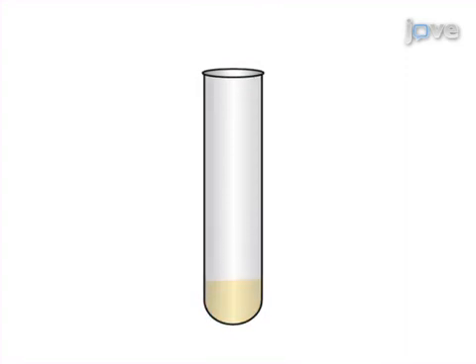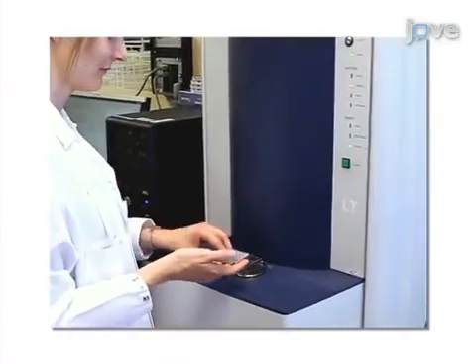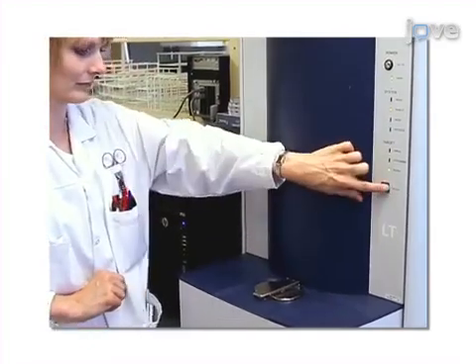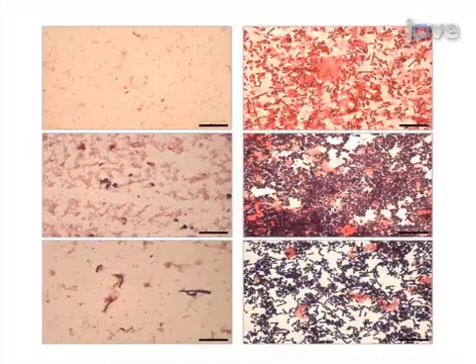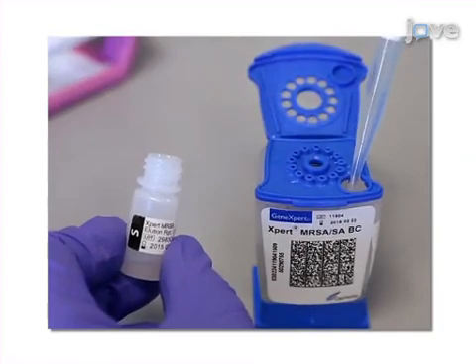After a second round of centrifugation, the pellet is re-suspended in water. The final step is to use the obtained pellet for bacterial identification by matrix-assisted laser desorption ionization time of flight, gram staining, antibiotic susceptibility testing, and/or PCR-based tests.